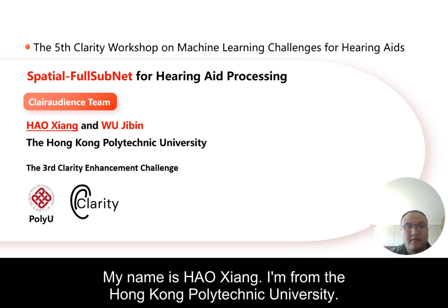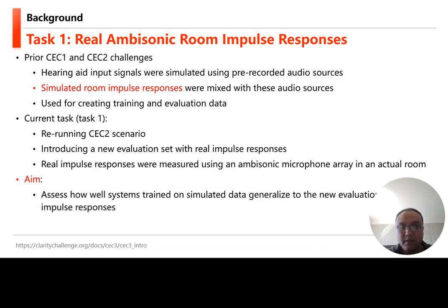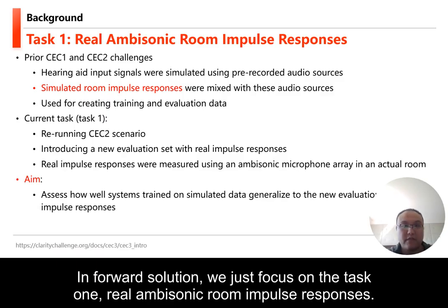My name is Hao, from the Hong Kong Polytechnic University, and it's my great honor to present our work titled Spatial Full Subnet for hearing aid processing. For our solution, we just focus on task 1, real ambisonic room impulse responses.